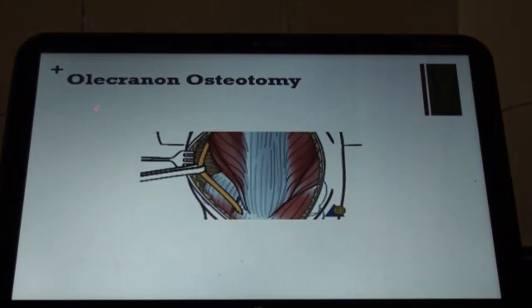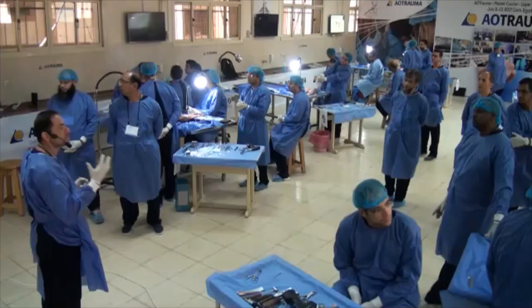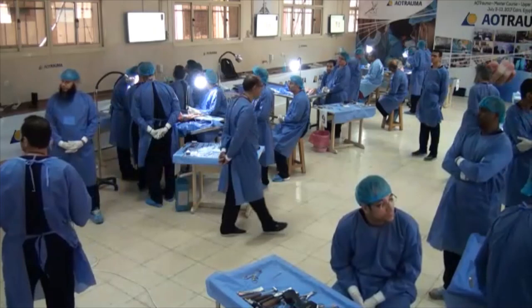After the skin and subcutaneous tissue, you need to identify the nerve first — always start with the vital structure. Then you need to release the lateral side.